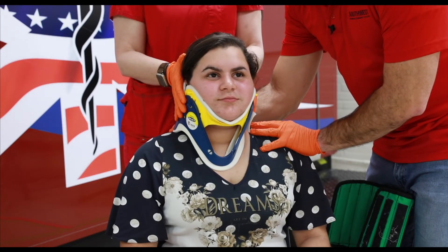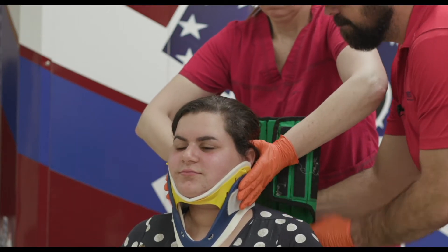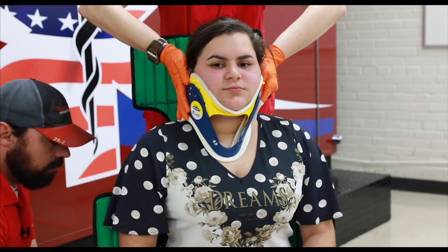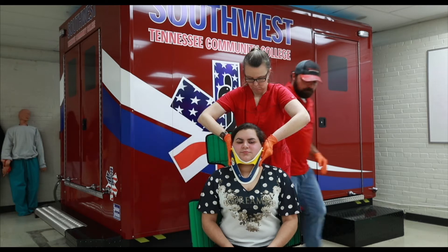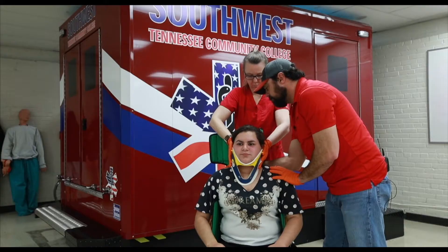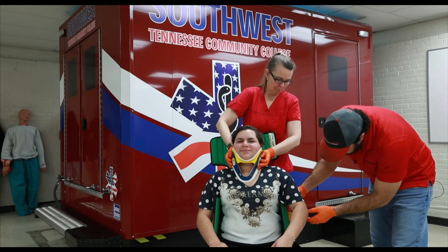I like to feed this between the arms and around the back. Obviously, this is a lot easier to do in a classroom with a chair — if you're working with a car, not so easy. Now that we got this on the other side, it makes it a little simpler. We're going to move the patient back and put this up underneath the arms. We need this part to go directly underneath the armpits. Making sure that's a nice snug fit up under the armpits.